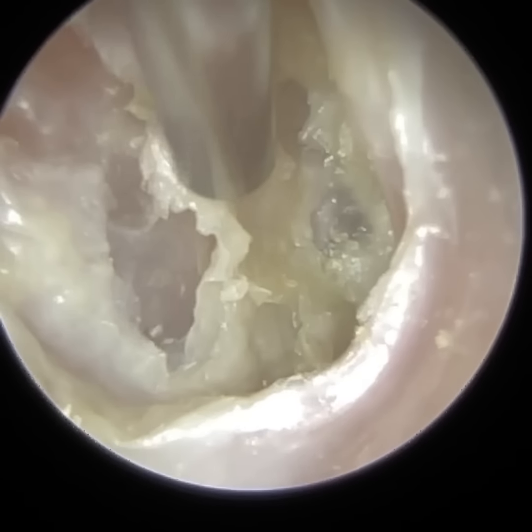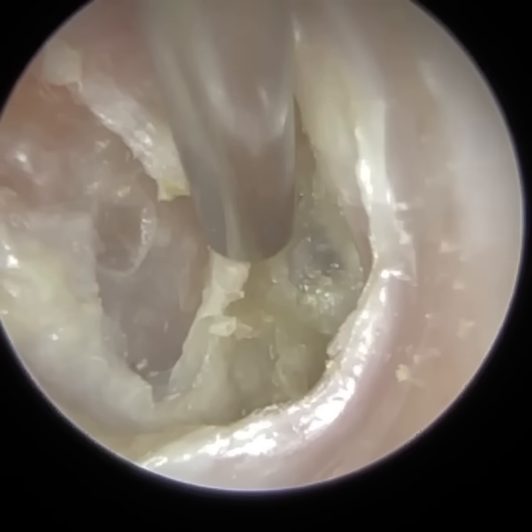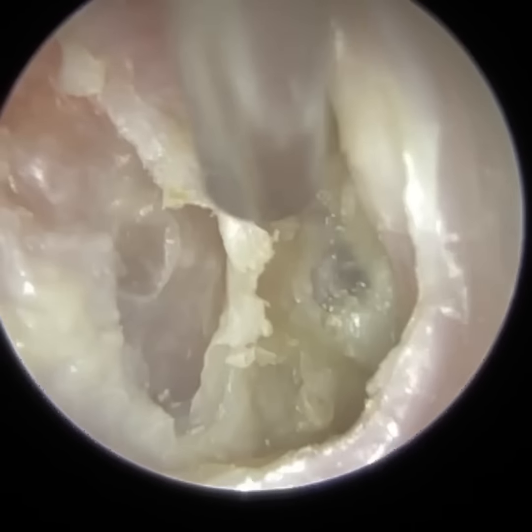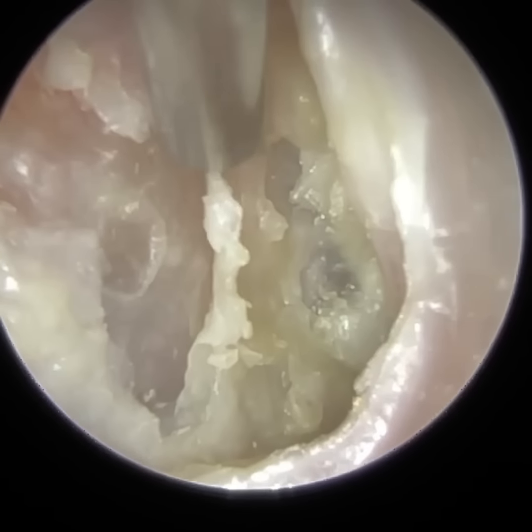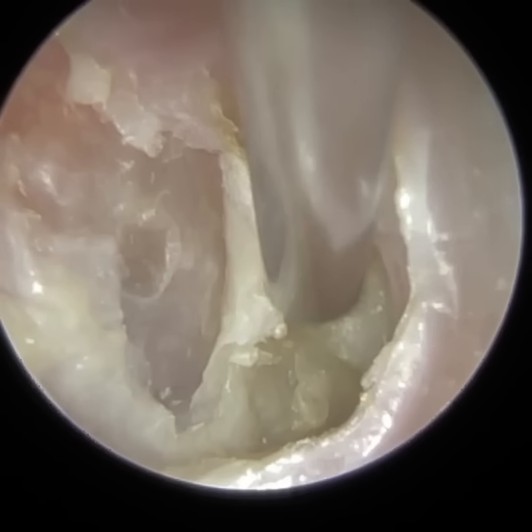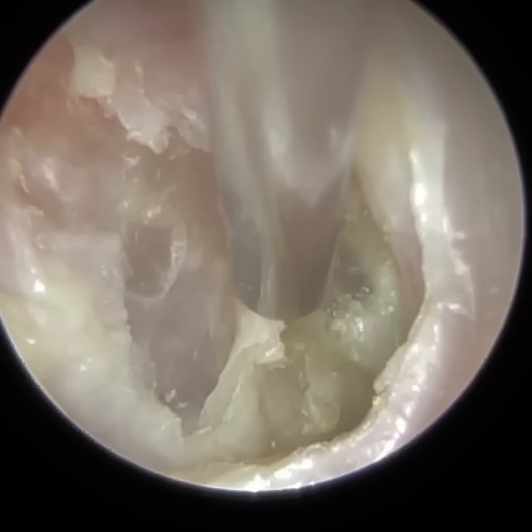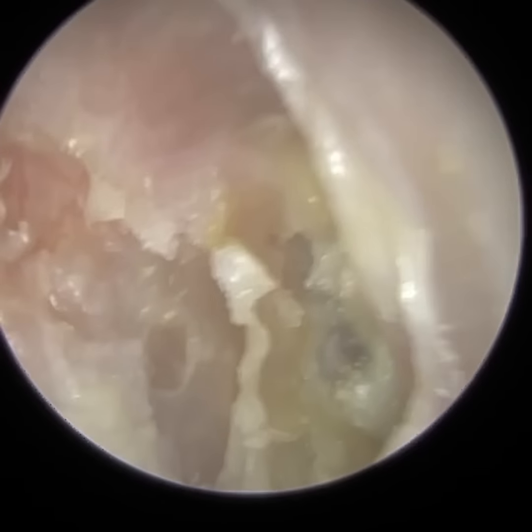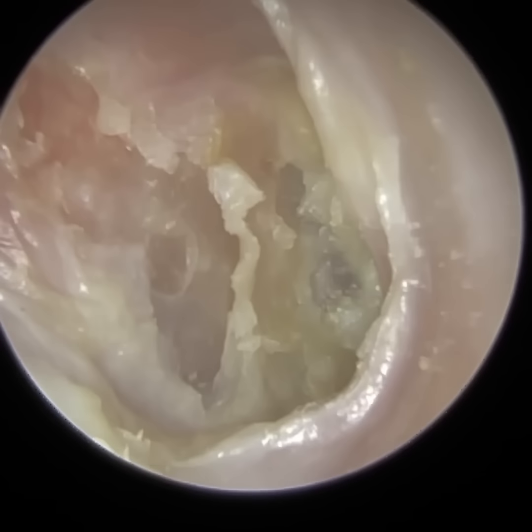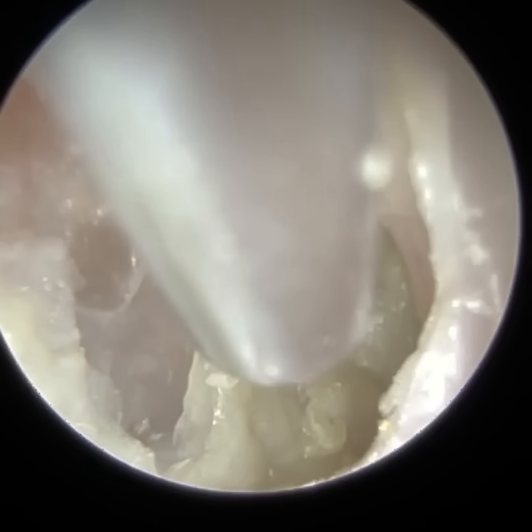So whilst Connor was here, I introduced him to the suction tips that I'm now using. In the UK, generally, we use a Zollner suction probe, which is a metal capillary tube integrated into a handle. It's either bonded or injection molded, so it comes as one piece. If you then want to use a fine end, it's like an extension that you push onto the end of the Zollner, which increases the length.